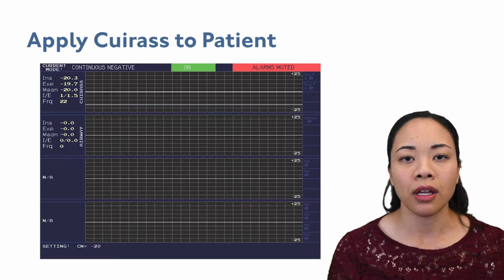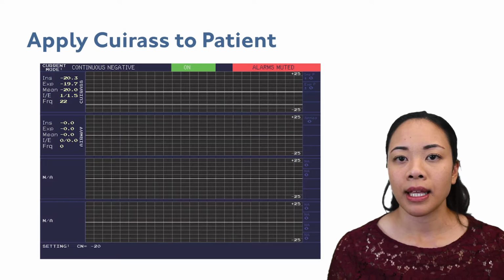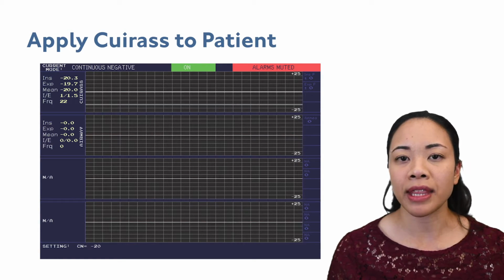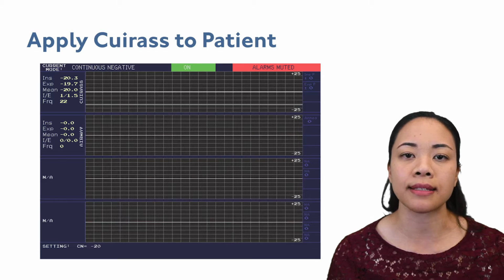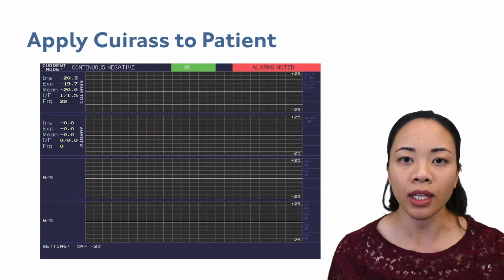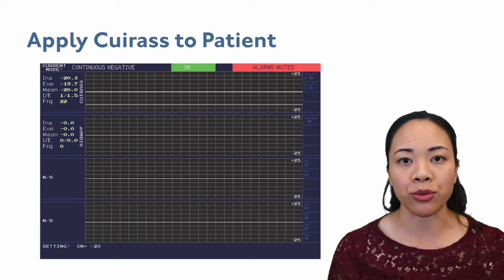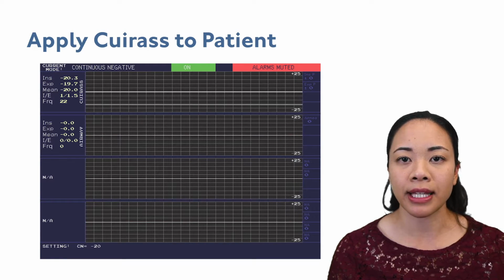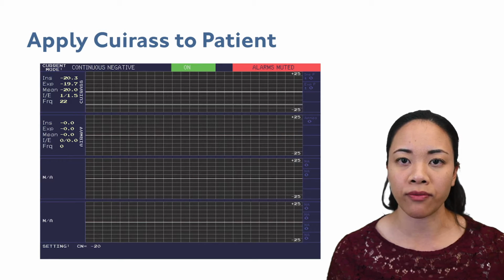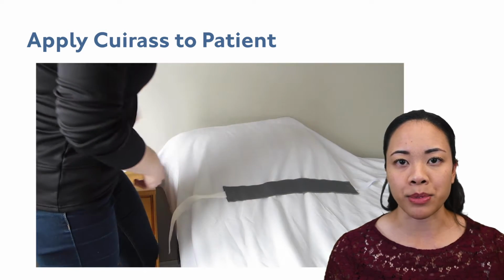As a reminder, top center of the screen should change from standby to on, highlighted in green. If that change does not occur, you may need to press it again with a lighter touch as the keypad is sensitive. You will note that the actual monitoring values on the left-hand side for the Cuirass graph now reflects the values set, meaning the inspiratory pressure, if set at -15, now reflects between -14.5 and -15.5. It is now safe to secure the straps in place.